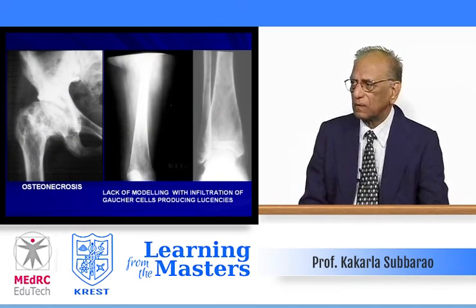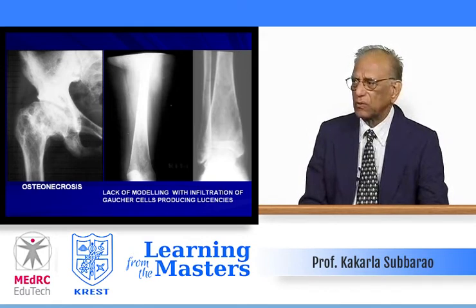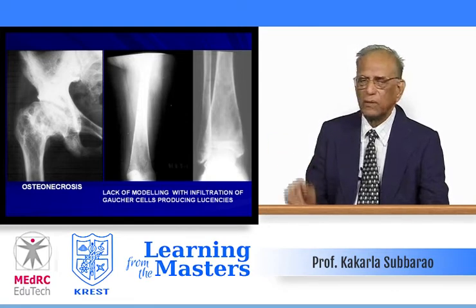Look at the radiograph of the hip on your left: osteonecrosis, and also marrow changes in the neck and proximal part of the femur. And on the right, lack of modeling with infiltration of Gaucher cells producing multiple permeative lucencies.